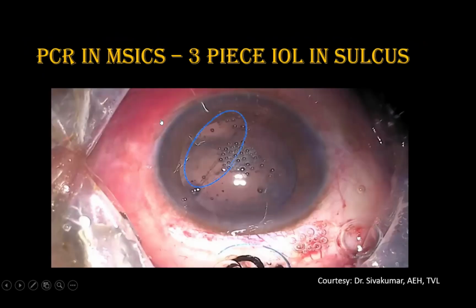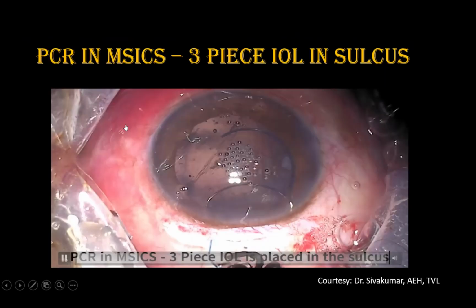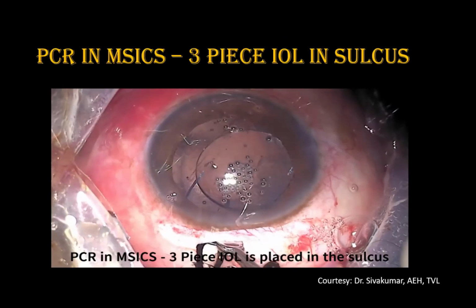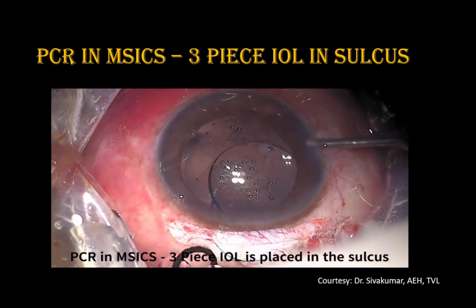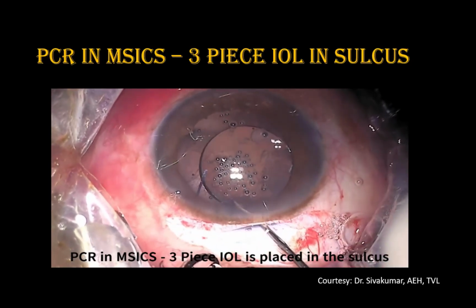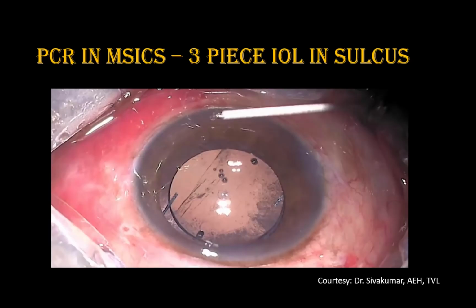In this case, you can see that in SICS there was a large PCR. So how to place the three-piece IOL? You have to aim for sulcus placement. When you are placing the IOL, you can lift the inferior part of the pupil or iris with your leading haptic, so that you are sure it is going into the sulcus. If you tilt or bend it as if you are aiming to place it in the bag, then it will go into the PCR area. So you have to dial it horizontally instead of dialing it downward.